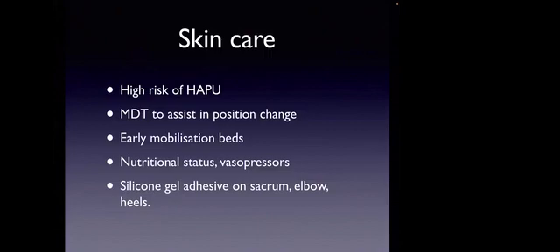Any other healthcare assistant and the perfusionist, who is going to make sure that the cannulas are well secured, not getting displaced or dislodged. And it is better to be done under the supervision of the physician who is on duty at the time.